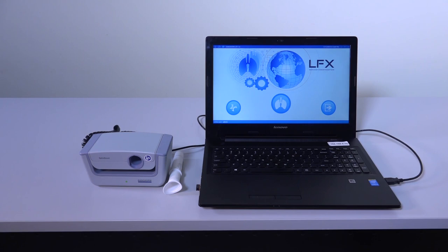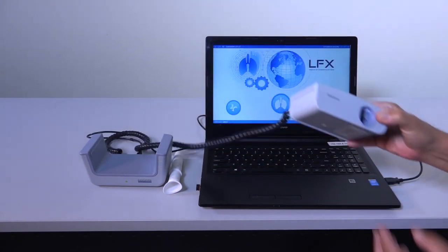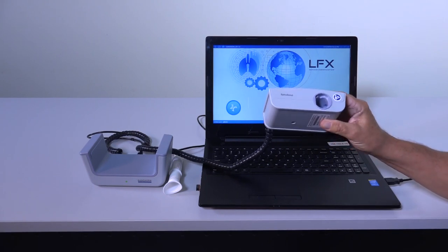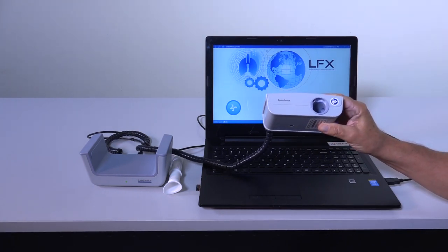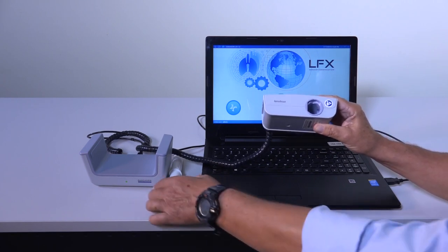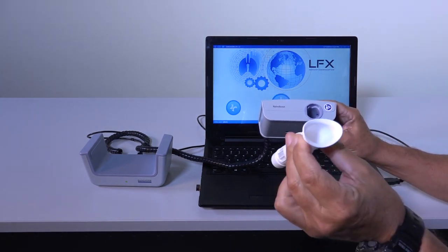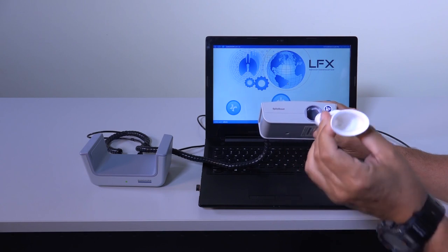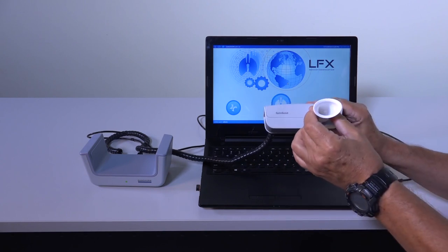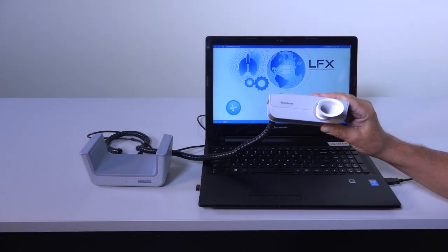Today we're going to talk about the SpiroScout, manufactured in our plants in Ganshorn, Germany. The SpiroScout is an ultrasonic spirometer which allows you to do spirometry without the need of any calibration, as other spirometry devices require. The SpiroScout uses the Scout tube, which is just an empty flow tube with no resistance, adding almost zero workload to the respiration of the patient.